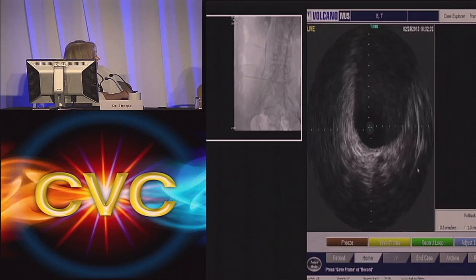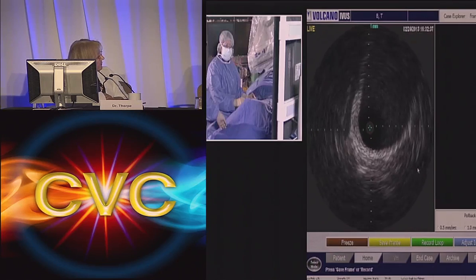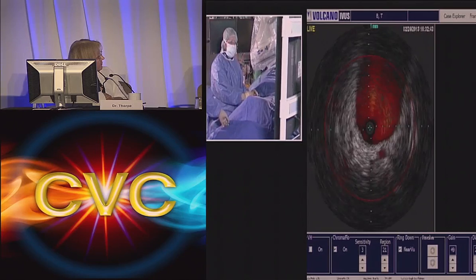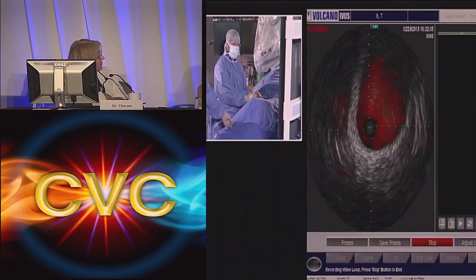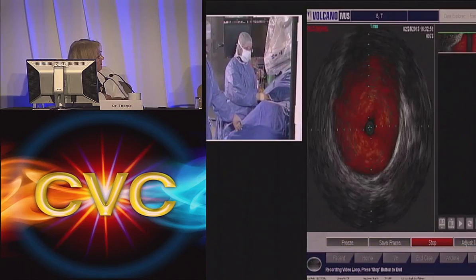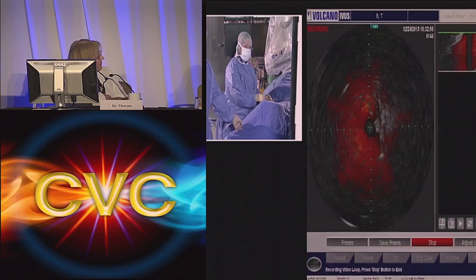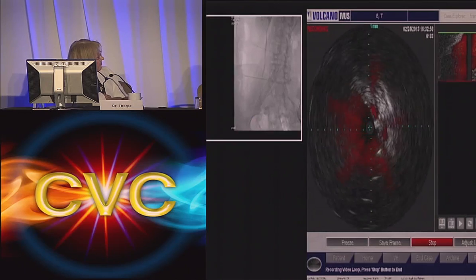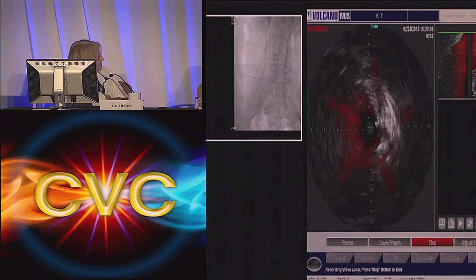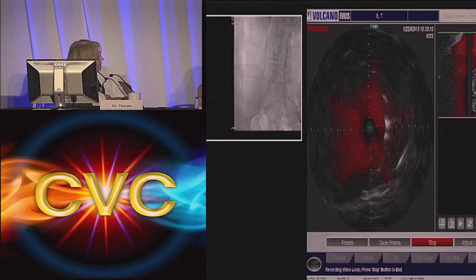Now, if you would put on the chroma, please. Color flow. And we'll show you with the color flow. Record. Okay. And we'll pull back from the IVC, and you will see that the stent is not too far in the IVC. There's good flow from the right side. And there's the thickening, the high-density echogenic material from the old May-Thurner compression. And the stent is open with good flow through that.